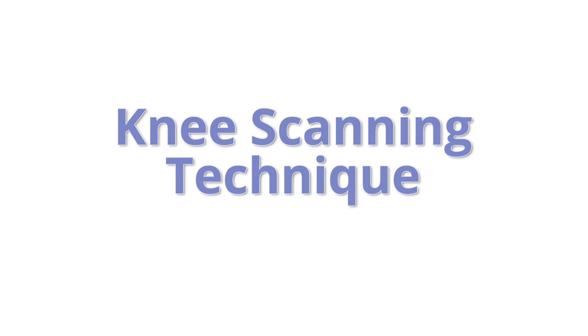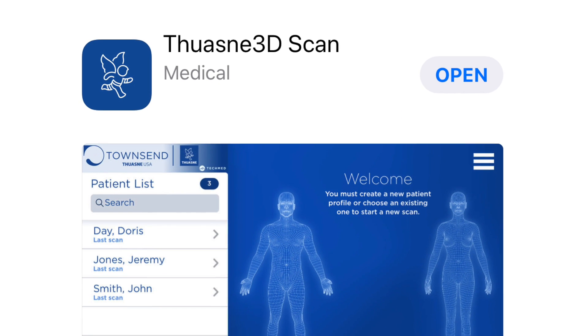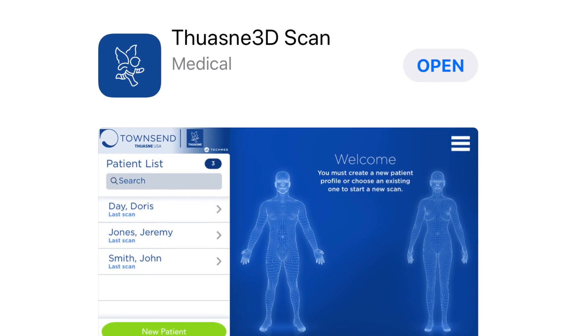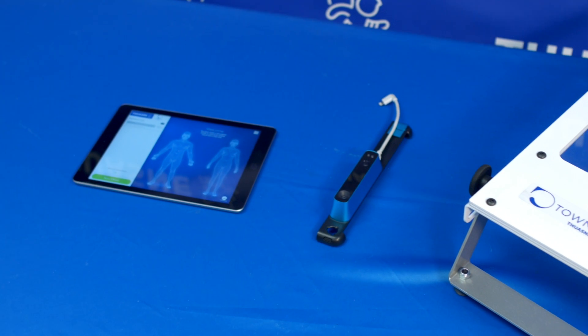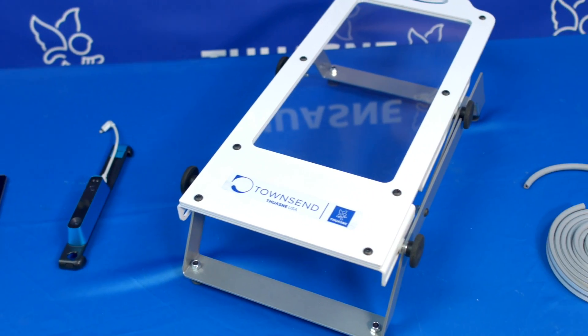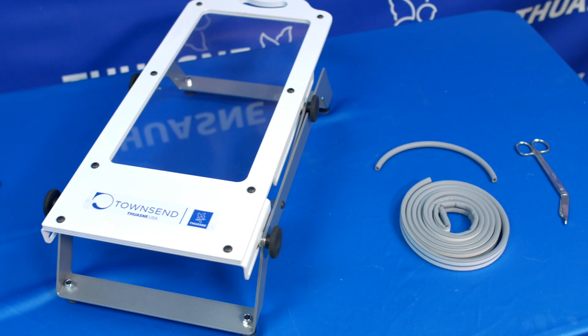Knee Scanning Technique. Please have the TUAN USA 3D app downloaded and all the necessary materials before beginning: iPad, Structure Sensor, Sensor Bracket, TUAN USA Footplate, and Physical Landmark Marking Material.